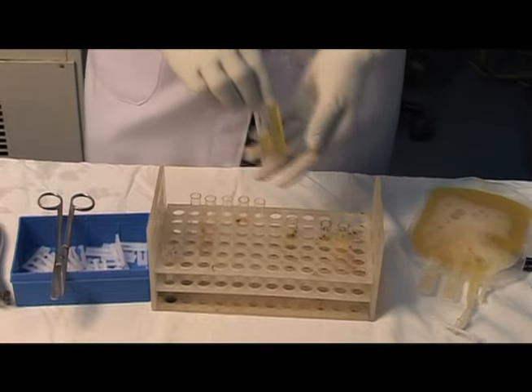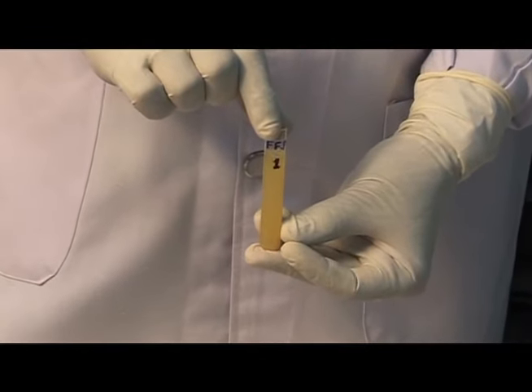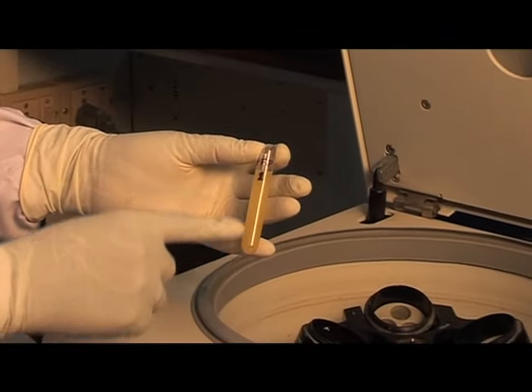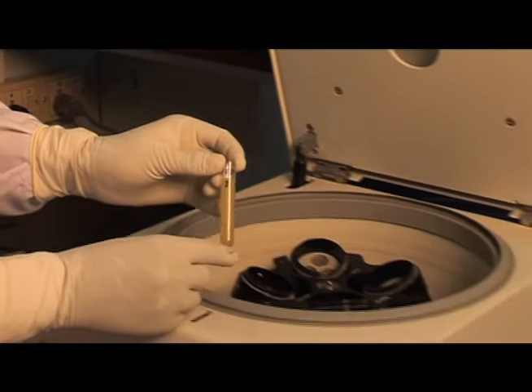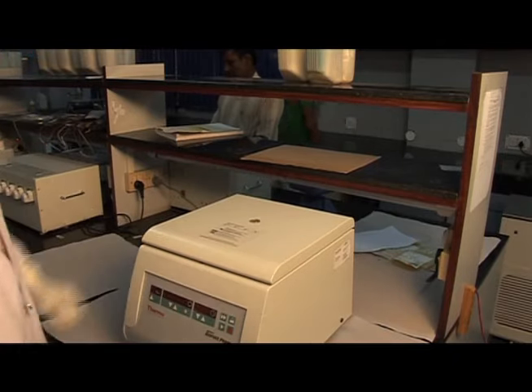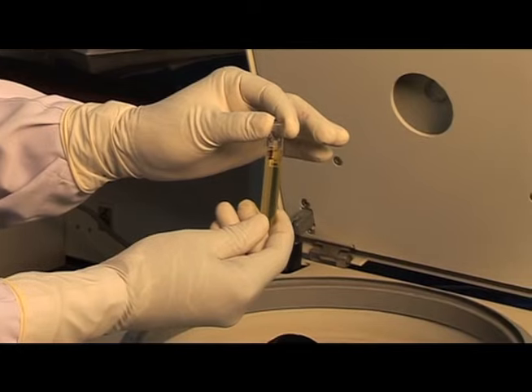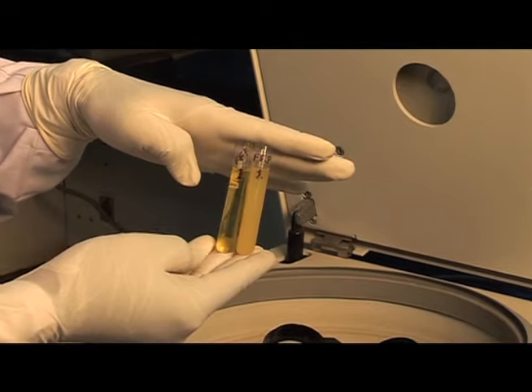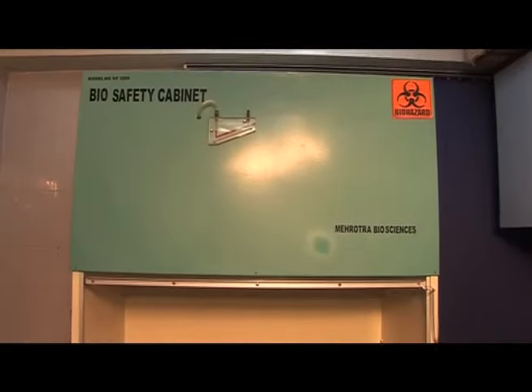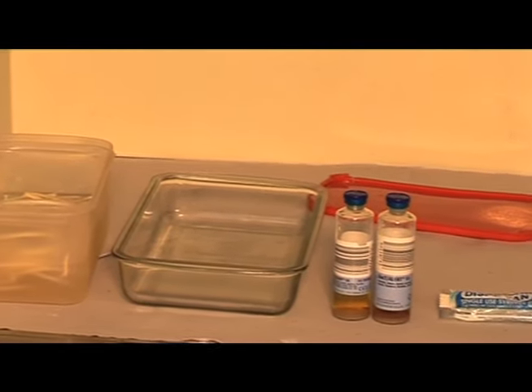and before actual testing, the sample is centrifuged in order to settle any flocculations which are present. The test tube is placed into the centrifuge. And here we can compare the samples, how they appear before and after the centrifugation. This is a biosafety cabinet. It is used for sampling of components for bacterial culture.